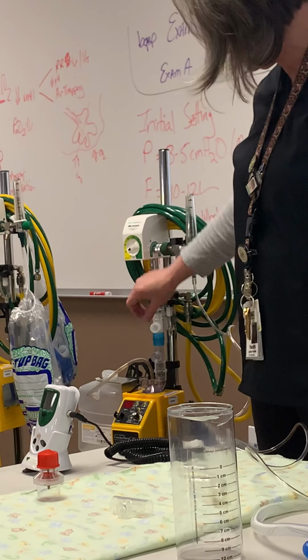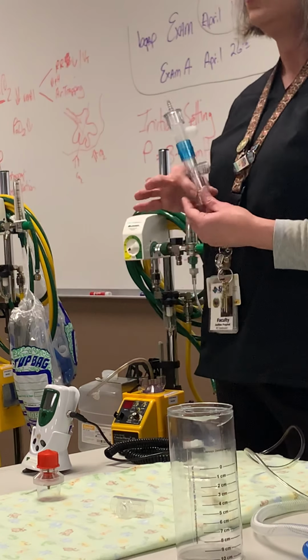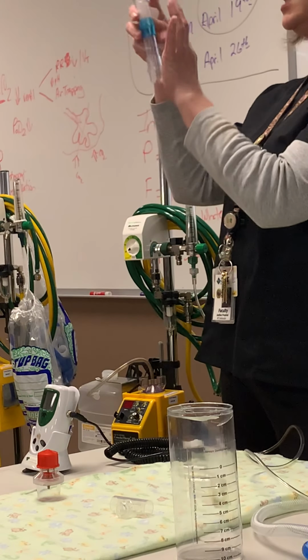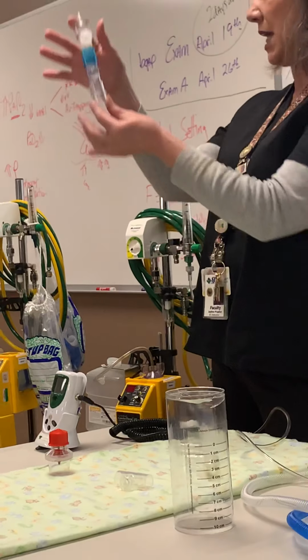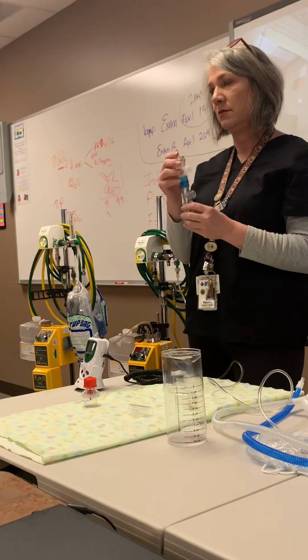Now you may have noticed that I am not shoving this on here. Please don't. When you start shoving things on this particular concha, you start cracking these. You get little fine cracks in here, and you're never going to get a good seal for your bubble CPAP system. So you can put it together outside or you can put it on here. If you put it together on here, just don't jam it on, all right?